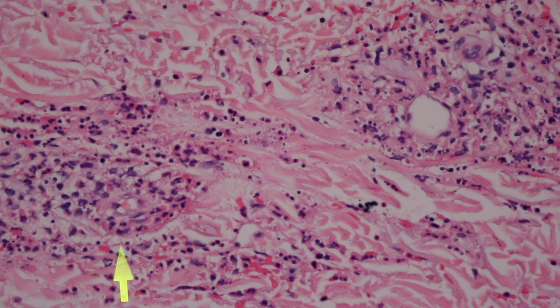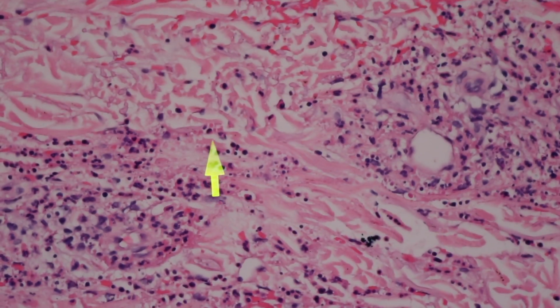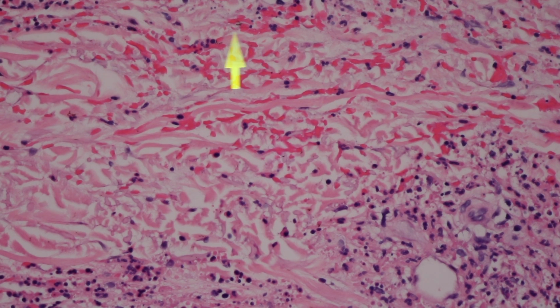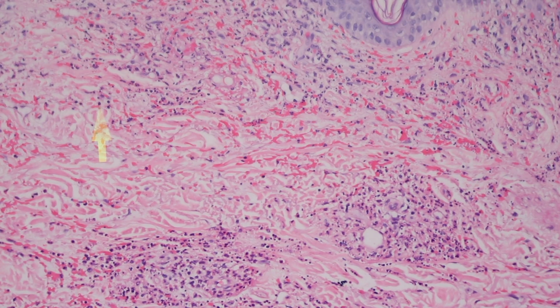So anytime you have a reason for neutrophils to be around in the skin, like an abscess or something like that, don't be surprised to see neutrophils coming out of vessels, and don't necessarily think that that means it's LCV. But when you do find fibrin in the vessel wall and you do find nuclear debris, and also, it's a nice hint, you don't always have it, but oftentimes you're going to have red cells that are scattered out in the dermis, and they tend to be kind of trickling in between the collagen bundles like this, and they tend to be localized near the damaged vessels, so superficially.